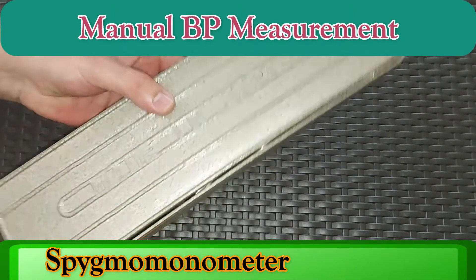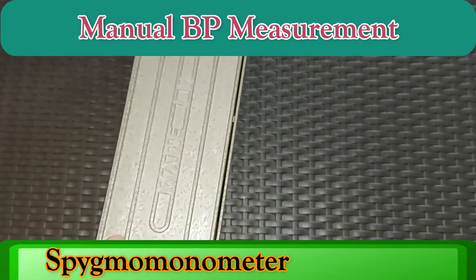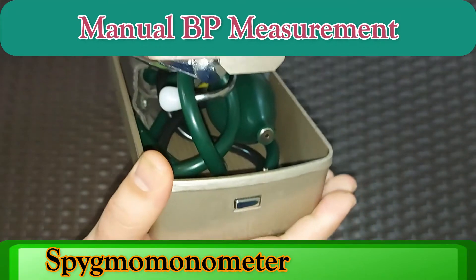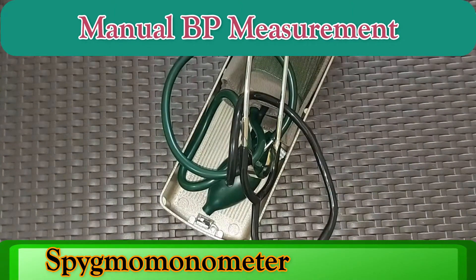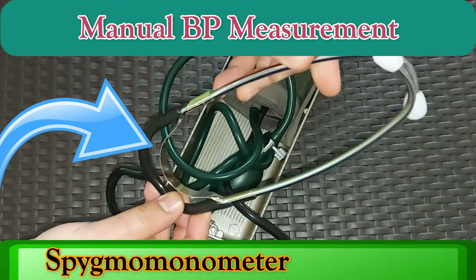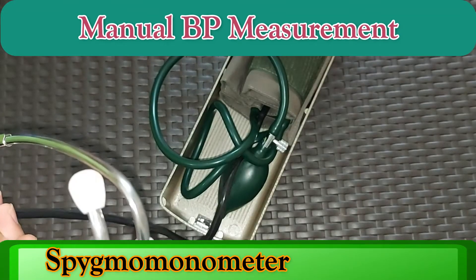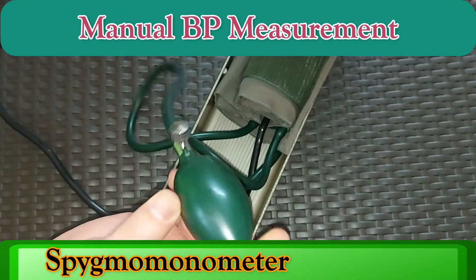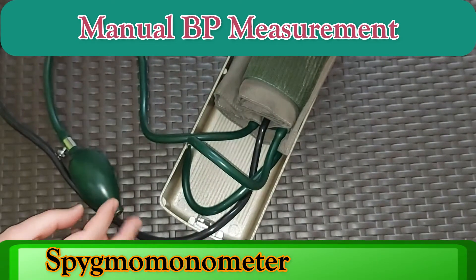This is the manual BP apparatus, medically known as a sphygmomanometer. I'll show you the parts so that you can be familiar with them. First, there is a button — by clicking this you can open the sphygmomanometer. After opening it, you will see certain parts inside. First of all, this is something called a stethoscope, by the help of which you can feel the pulse — known as systolic or diastolic. And this is called a pressure bulb, which is used for inflating the BP cuff.